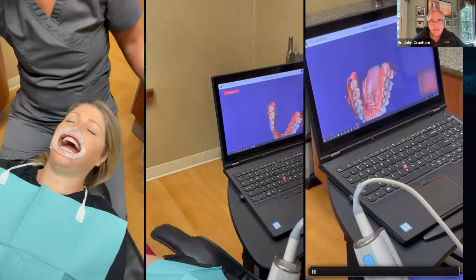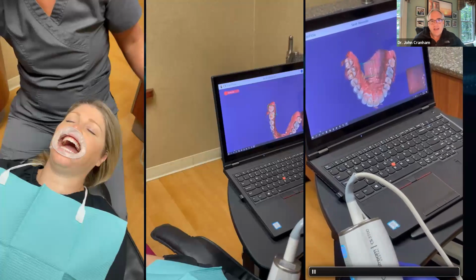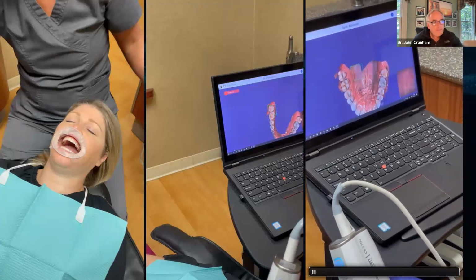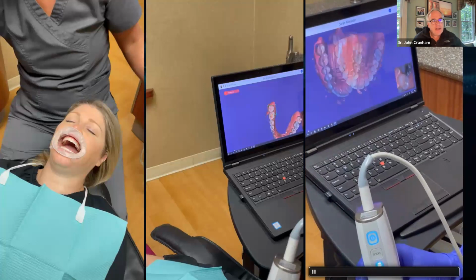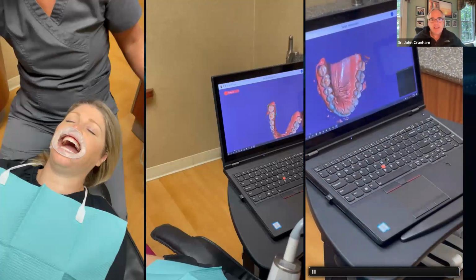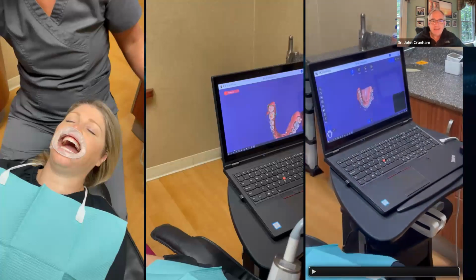It's kind of like, back in dental school, they were picky about how we got our alginates, that we would get all that data. So that can be done really, really effectively and very, very efficiently. So again, what I want you to think about is that scanning by and large is replacing impression material. It's allowing us to get data that we can then send to the lab.